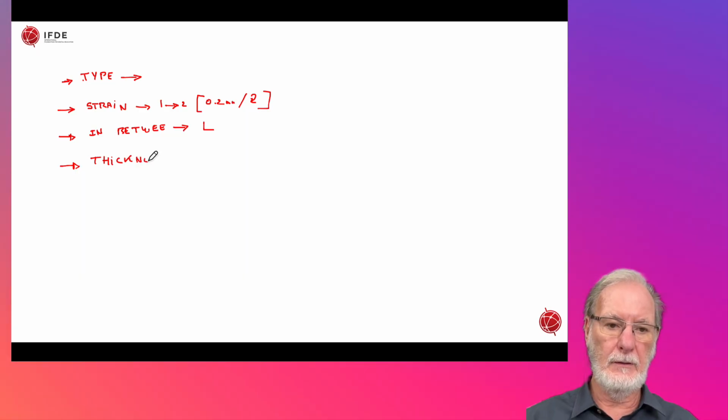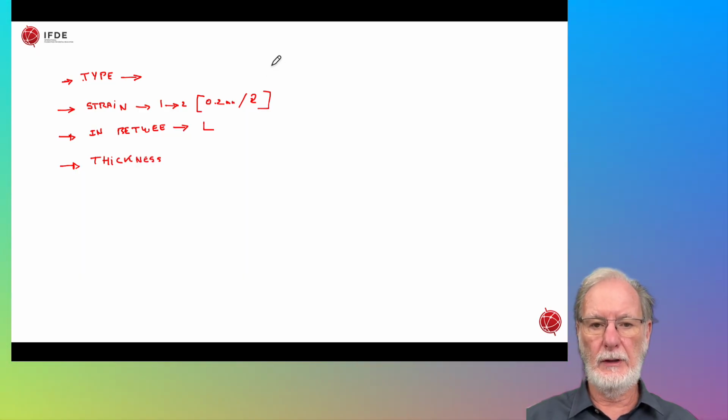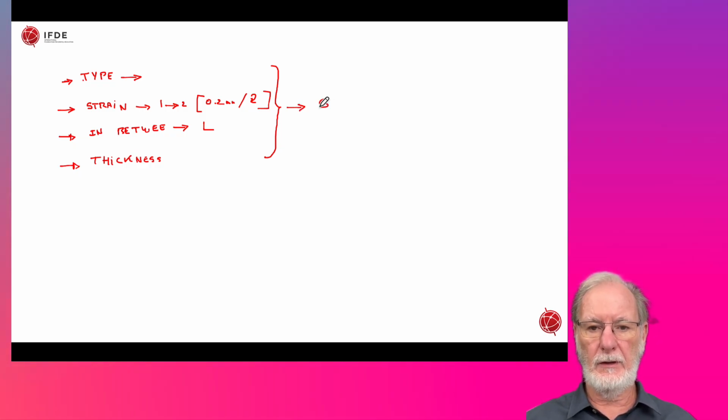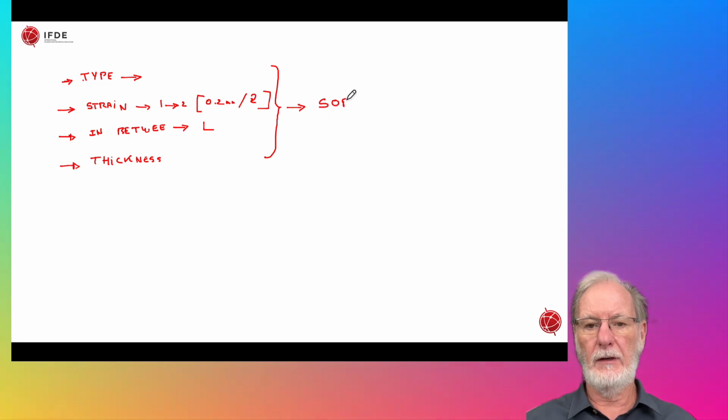And when you can get all these into an equation, which is very difficult to calculate because it has to do with tooth anatomy and periodontal support, then you can optimize your software for every single case.